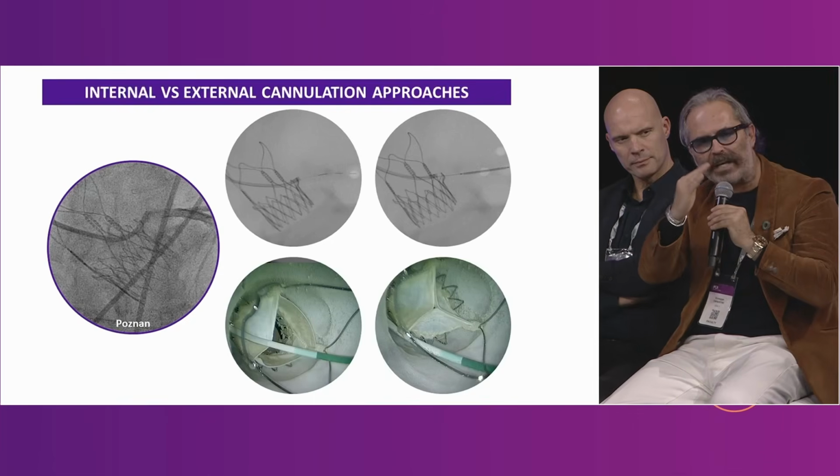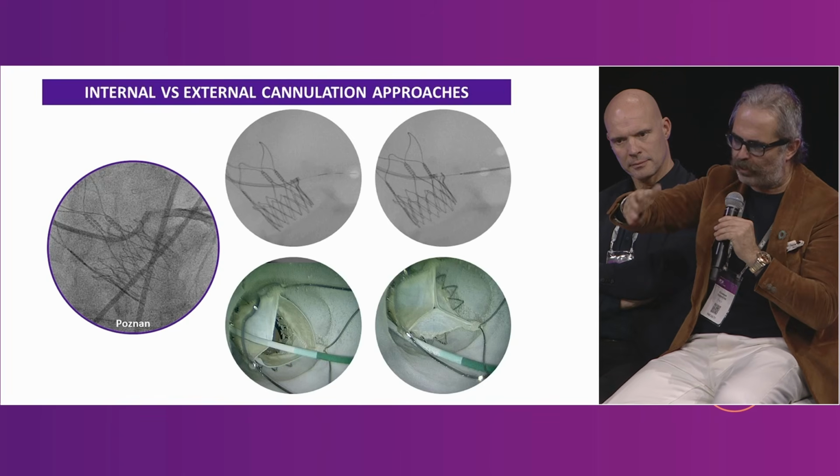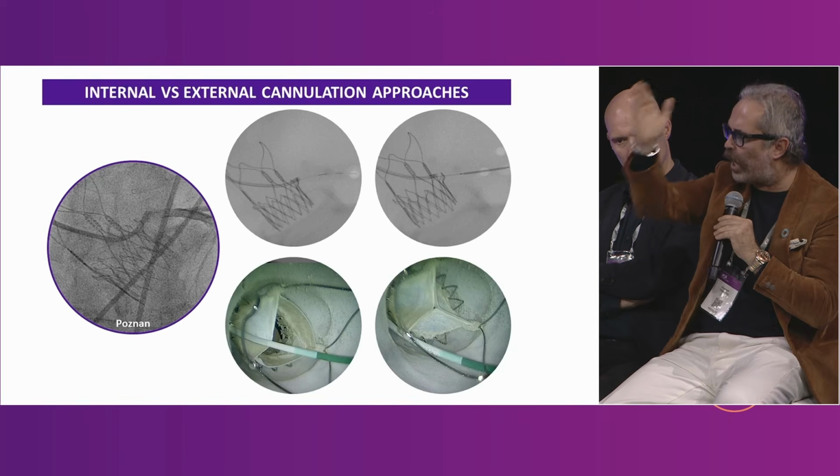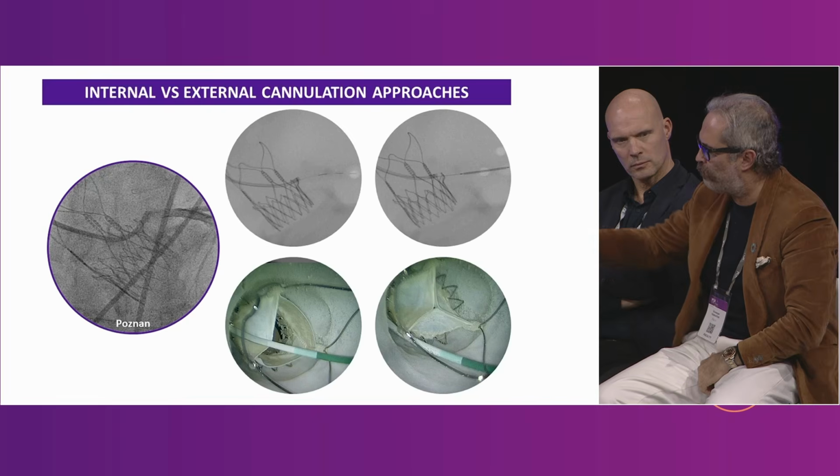I think a point in favor of this valve, which is important also to share with the audience, is that as you nicely have shown, you can get into the coronary artery from outside of the struts, considering that in this valve the leaflets do not hit the struts, so it's not possible to tilt up completely the leaflets. You have an extra space between the maximum excursion of the leaflets and the struts. So you can get to the coronary outside of the leaflets or outside of the struts. This is an important point because this is not true for all the self-expandable valves.